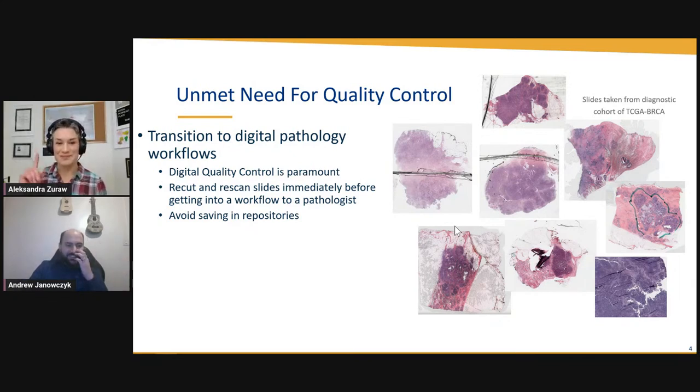You wanted to ask a question. Yeah. You said, and you can let me ask the question whenever you're done with your thought, that's perfectly fine. You said you can use them while the slides are in the scanner. Are you going to talk about that or shall we talk about that now? I want to know how this happens. Yeah, we can talk about it. What the non-computer scientist users are used to is, okay, first is the scanning, you have the scans, then you run some kind of algorithm, then you see something, and you go back.